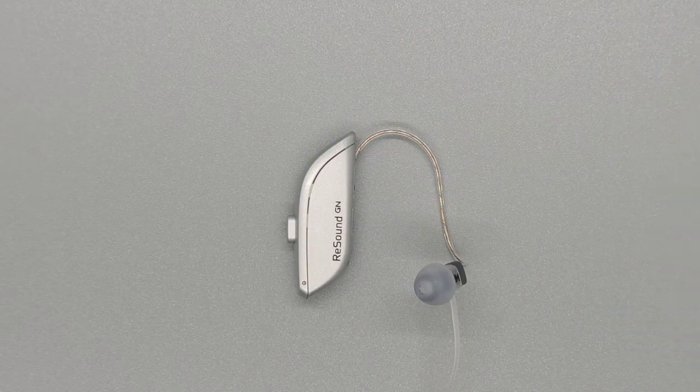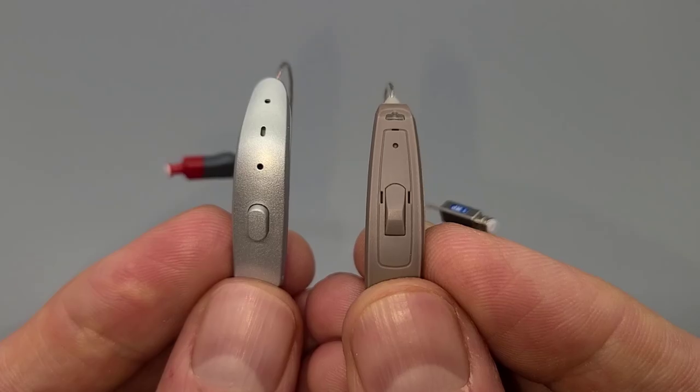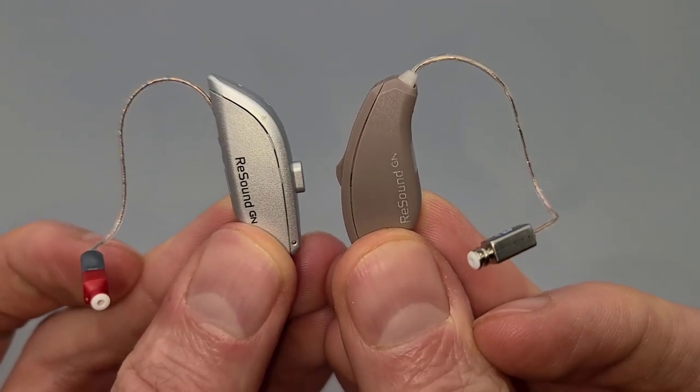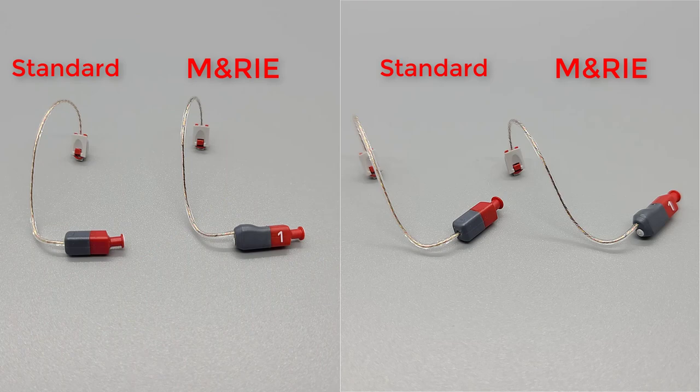In terms of appearance, the ReSound One has a point at the top and a point at the bottom, and it kind of reminds me of an elf ear. The rechargeable version is thicker towards the top of the hearing aid. ReSound has also introduced two new receiver designs, one of those being the new MARIE receivers, which stands for Microphone And Receiver In Ear. ReSound is the first to ever incorporate a microphone on the back of a receiver in the ear.